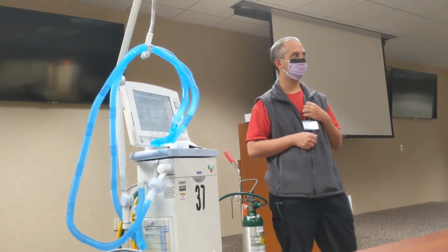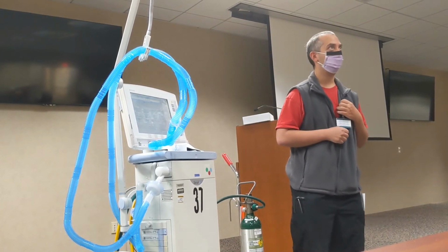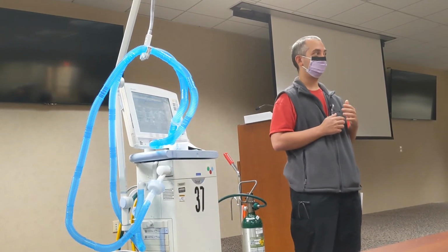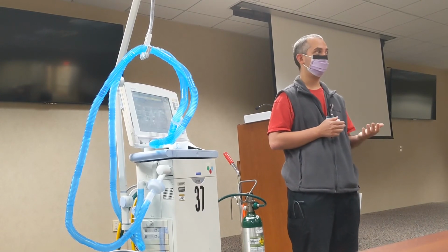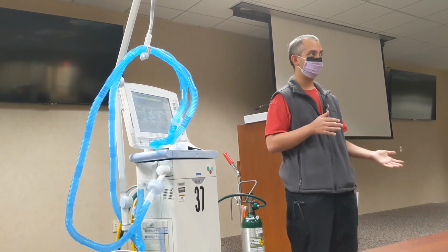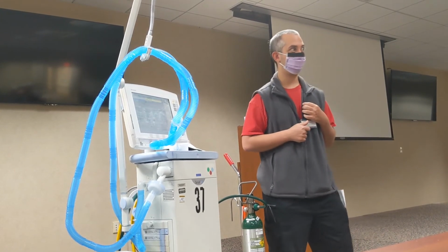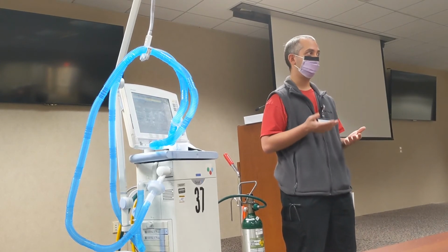For sedation, you still looking at something like Precedex or something? When I first started, at least with these COVID patients, most of them are in some deep sedation at first. And you bring up a good point. It doesn't matter whether they're just very lightly sedated or deeply sedated. The mode works for both. It works when they're paralyzed. It's just a matter of whether they're doing some of the ventilation on their own or not.